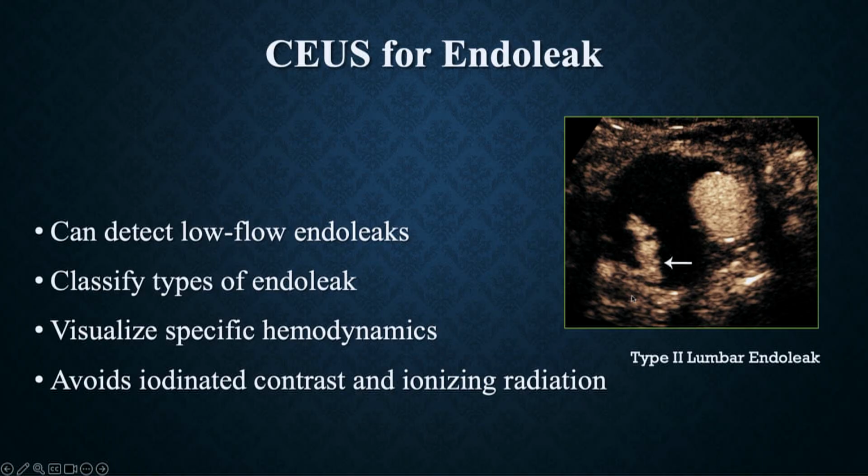As I mentioned, we do mostly contrast-enhanced ultrasound. Many advantages. There's no radiation to the patient. There's no need to give iodinated contrast, which is a benefit to the patient. We can do as many studies as we want, and again, with little risk to the patient whatsoever. We can detect low-flow endoleaks that CT angiography does not find. And I know this is a fact because many of the low-flow endoleaks that we find that are not seen on CT go on to angiography and they are confirmed.